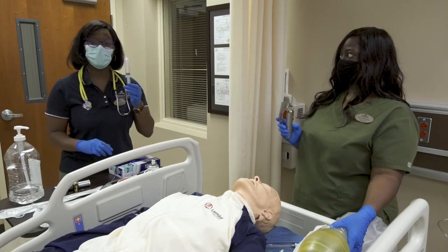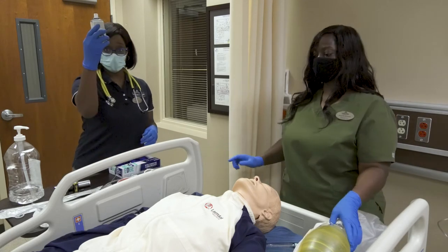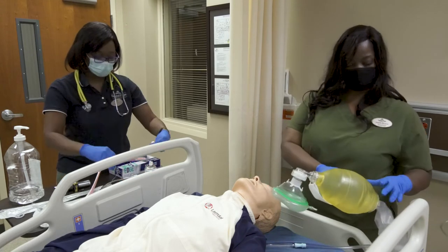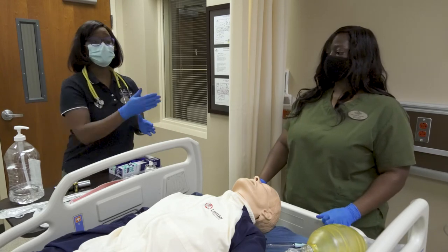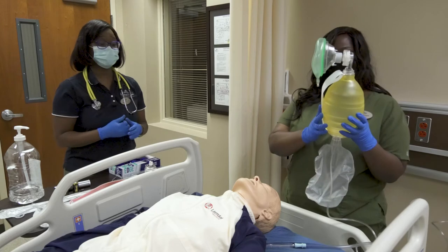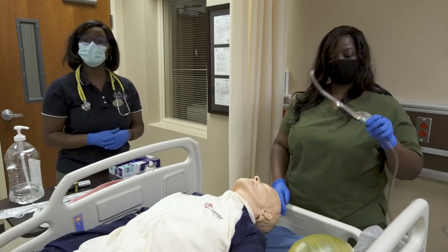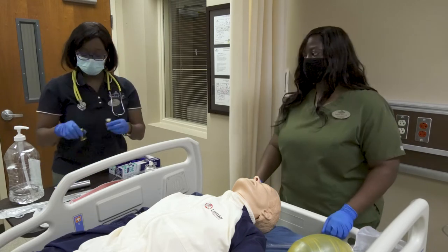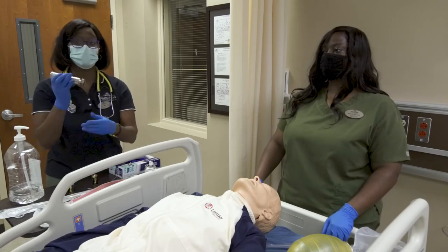You will need a syringe to provide 5 to 10 milliliters of air, a lubricant source, a tube holder, end-tidal CO2, an ambu resuscitation bag, and your suction source. Also, you want to make sure that you're fully prepared with batteries, as well as a backup blade just in case your laryngoscope malfunctions.